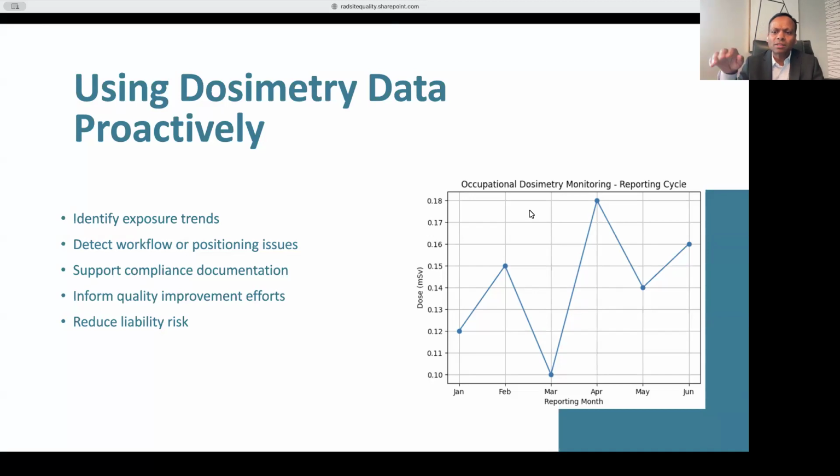Now, when we look at this graph that we are getting, it also depends on what dosimeter we are getting this reading from, right? So that will also give us much more insight. And in our practices, of course, we have physicists who are wearing the dosimeter, and we use dosimeters where you can get an instant reading. Like when you come home, you can press a button and it gives you an instant reading at the end of the day. So that's the benefit of having all the semiconductor-based dosimeters these days.